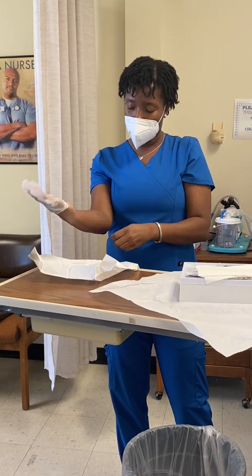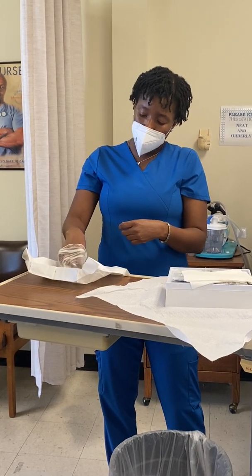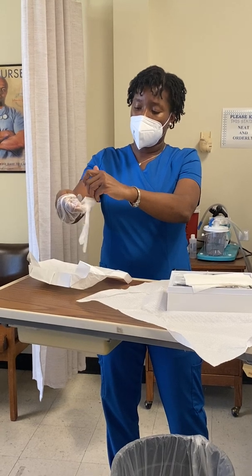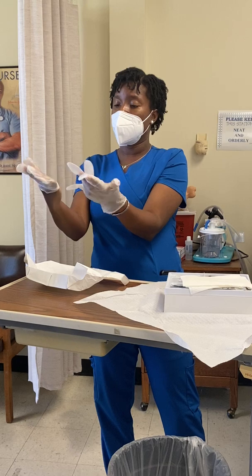See how that just doesn't want to go anymore, and I'm not going to fool with it. So I'm going to come over here, and I'm going to pick up my other glove. But that one went on pretty good.